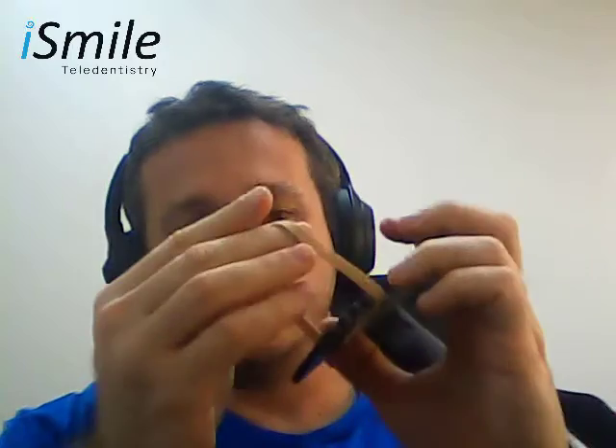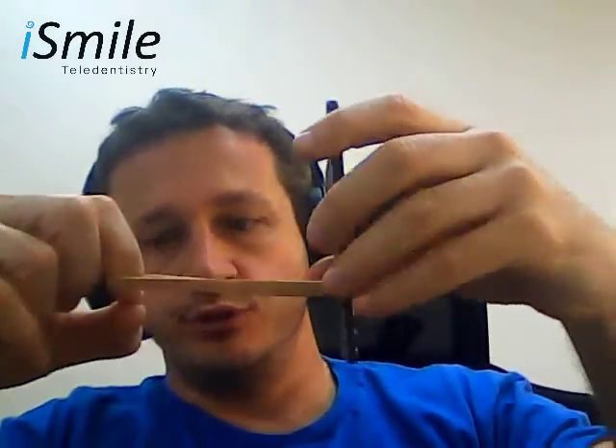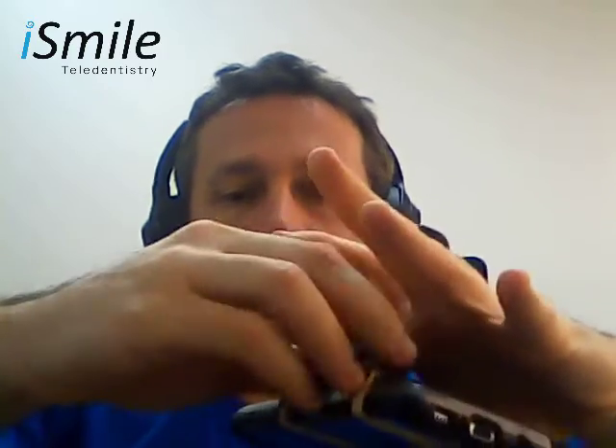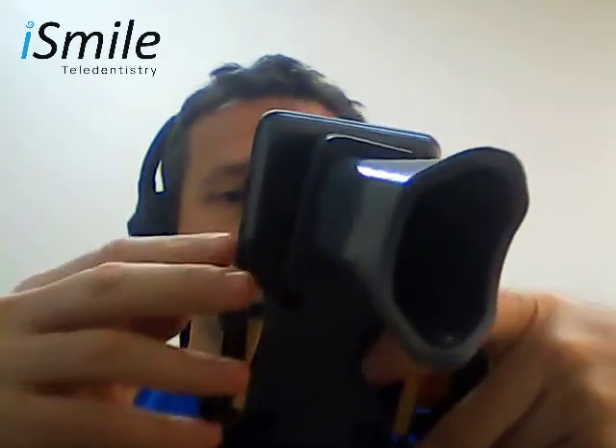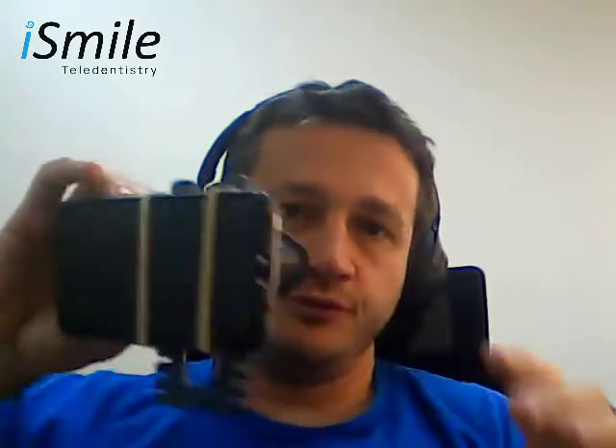Now for step number two, take the band that you have received and insert the band into the proper position. I had counted that the bottom of the phone is four ridges up, so I'm inserting the band into the fourth ridge. Now I'm going to place my phone in position, and I'm simply going to take the band, wrap it over the board and secure it in place with the brackets on the scanning device. I now have my phone securely fastened to the scanning device.